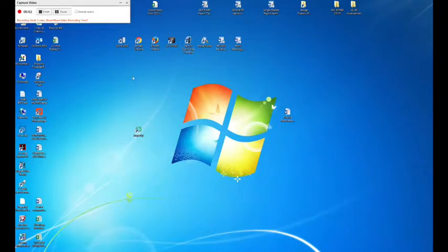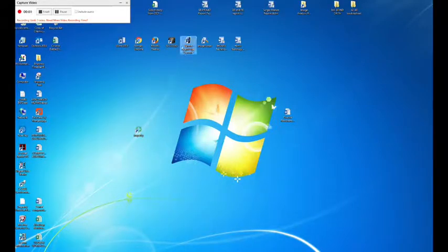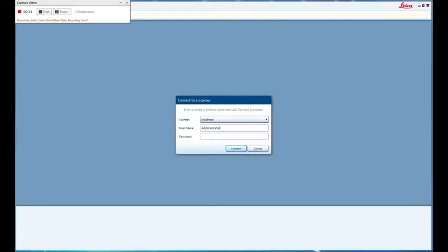Hey guys, it's Jacob here. I'm going to give you a tutorial on how to load the Aperio instrument. Start off by clicking the Aperio button there and entering in the username, which is administrator, and password is scanscope, and click connect, which will bring you to the screen.